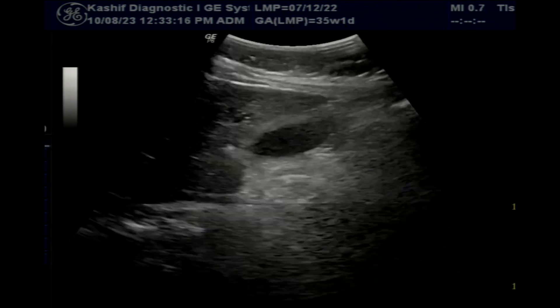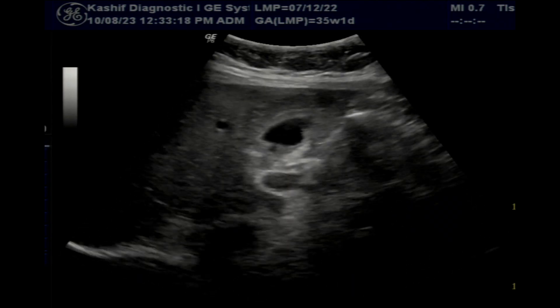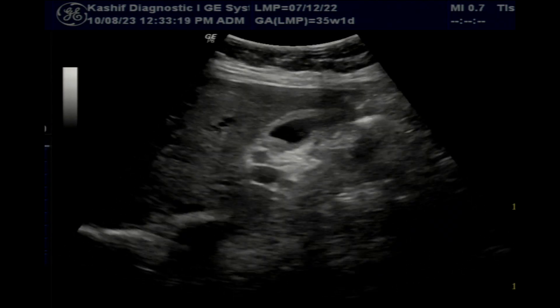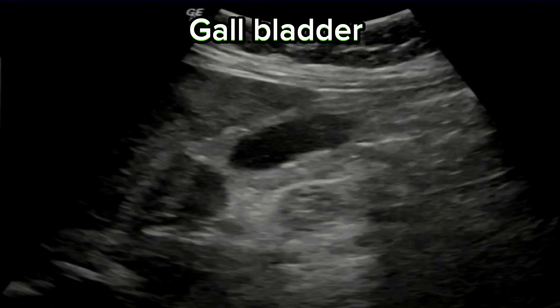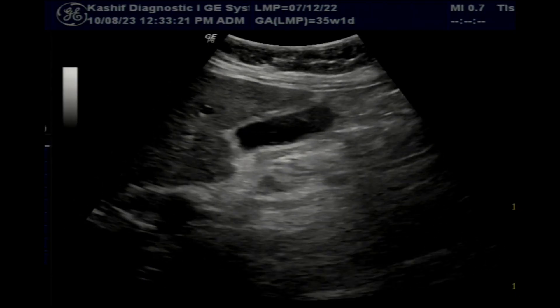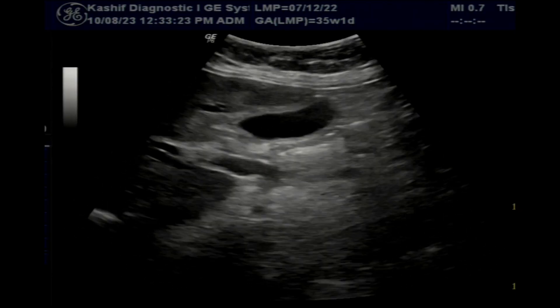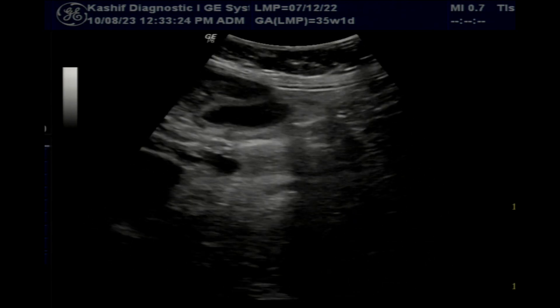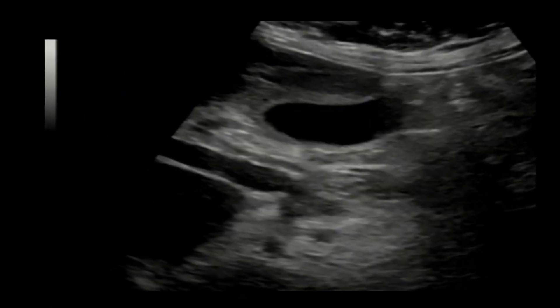This is the patient's gallbladder. It is normal in size, wall is mildly thickened, there is fine debris and small hyperechoic crystals. No significant gallbladder pathology or growth is seen.